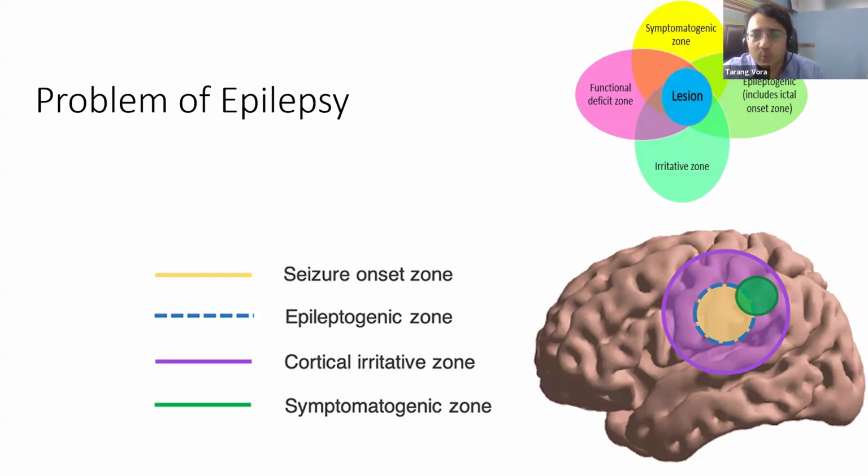So there are different ways to bypass that from a surgical perspective. We can open the skull and put the grid right on the surface of the brain, or we can do something like stereo EEG, where we put electrodes in the depth to make a recording of it, which is analyzed by the epileptologist to find out which area of the brain is responsible for giving an abnormal electrical impulse, which is leading to a drug refractory epilepsy.